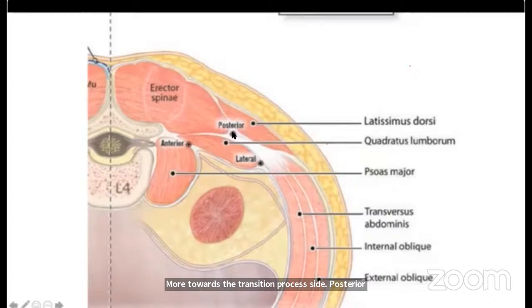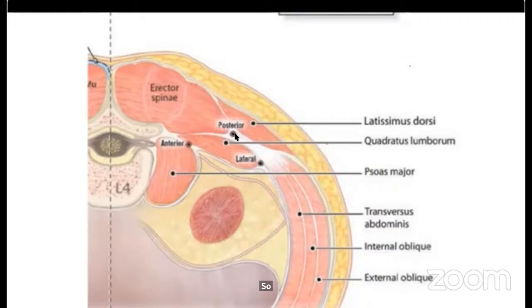Posterior QL, here the drug is deposited at the lateral edge of erector spinae on the posterior aspect of quadratus lumborum. This is like a switch button. There is not much rocket science. The needling skill set required is not much, because we just have to bathe the area and allow some amount of posteromedial spread between the erector spinae and the quadratus lumborum. So both blocks will have around 25 to 30 mLs of local anesthetic. Both blocks are promising for all laparoscopic surgeries and all laparotomies. When we have an operated spine or something where we cannot put an epidural, these blocks are comparable to epidural.